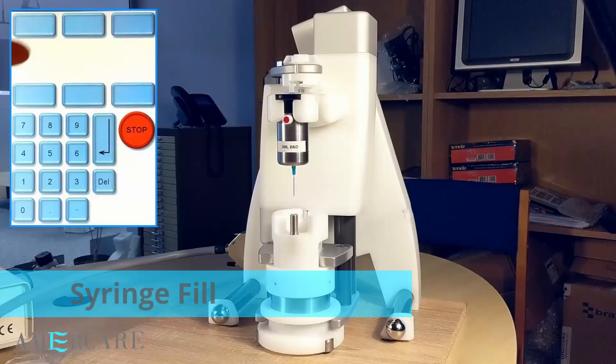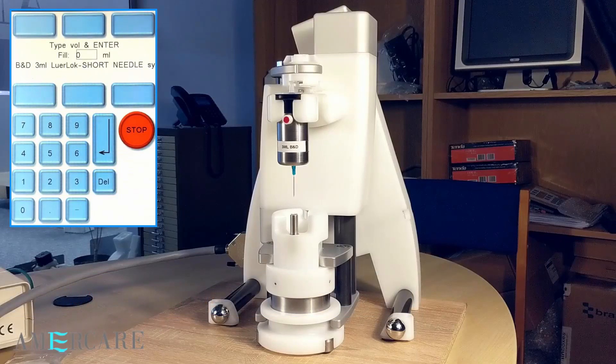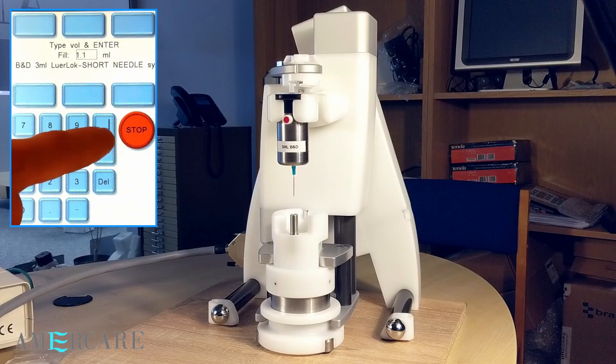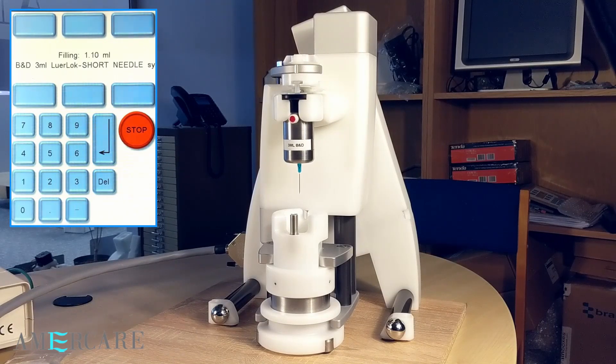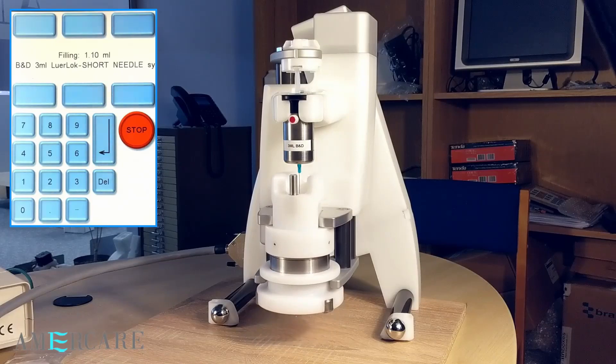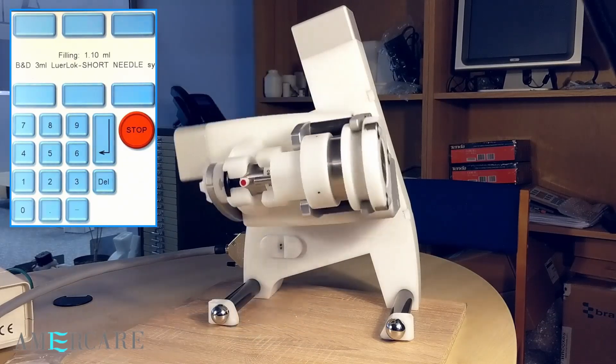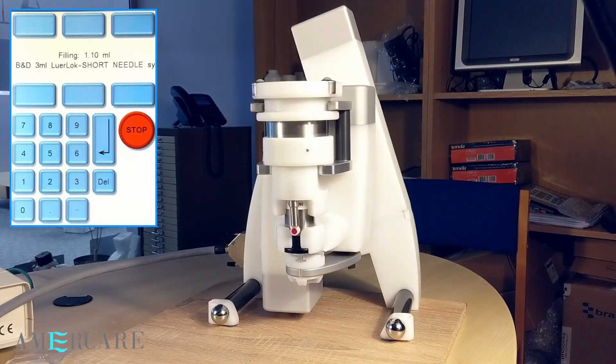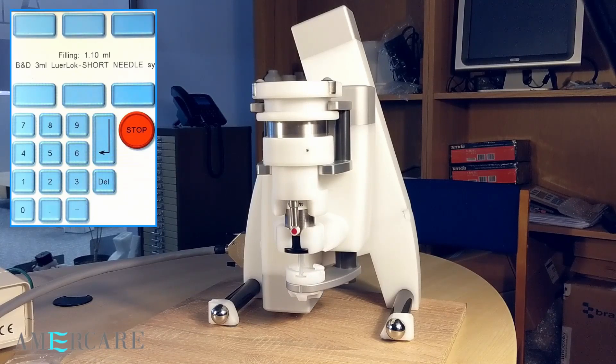To fill the syringe, press fill on the keypad. Input the required value, in this case 1.1 milliliters. Press enter to start the fill. The syringe will move in. The plunger draws up air equal to the fill volume and the carriage begins to lift. The head inverts and the air is injected into the vial. This is to keep the pressure in the vial at the end of the fill equal.